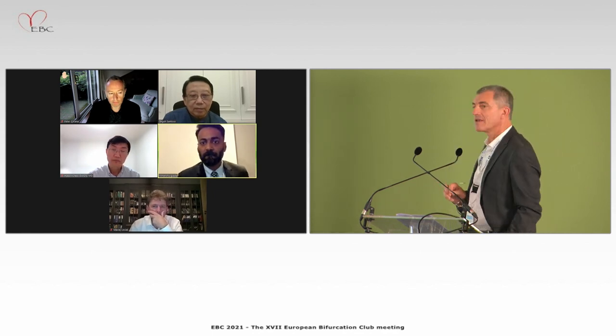Okay. Any more? Thank you very much. Can I just make a comment about that as well? Sorry, it's Peter O'Kane. Hi. I think the IVL balloon rupture, we saw that as well with the first generation, particularly when you've already used it and you're trying to deploy it in a new vessel where there's calcium, you're very likely to damage it further. I think maybe a strategy in this case, it was a brilliant case, but maybe just using a bigger burr in the left main might have facilitated slightly better preparation. And maybe then treating the circumflex. I think rotational atherectomy into the circumflex with that 1.5 burr may have also made life a bit easier. But you dealt with it very nicely. It's a really nice case. Thank you.